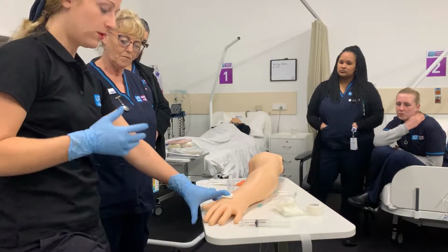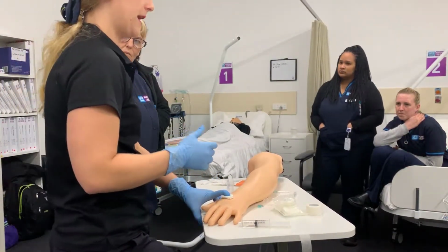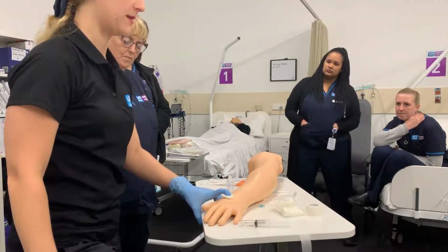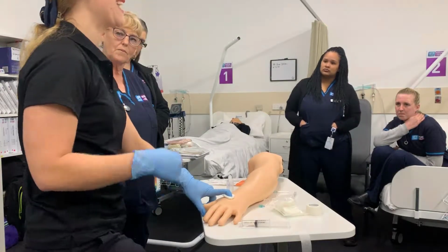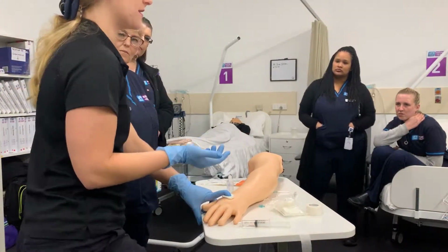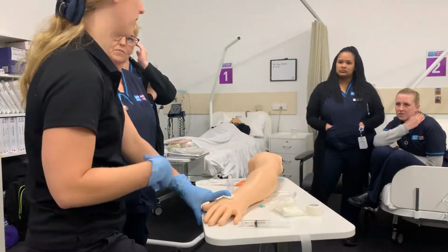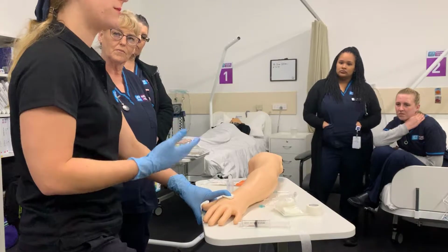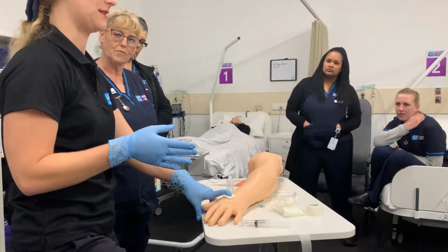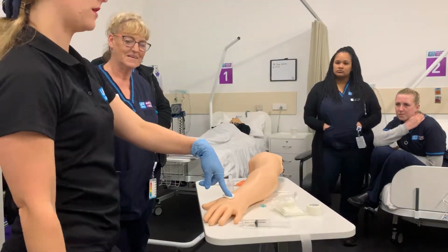Now, general rule of thumb is for a patient that is not on anticoagulants, you're going to hold pressure for 1 minute. For a patient that is on anticoagulants, which most of our patients are because they're on VTE prophylaxis to try to prevent DVTs, we should be holding pressure for a minimum of 3 minutes and as long as 10 minutes. 10 minutes is a very long time to be standing here.